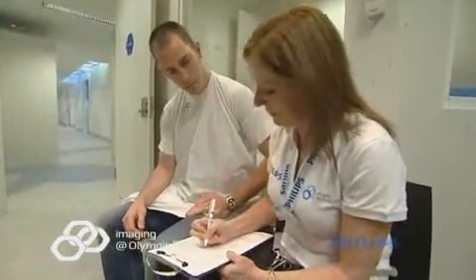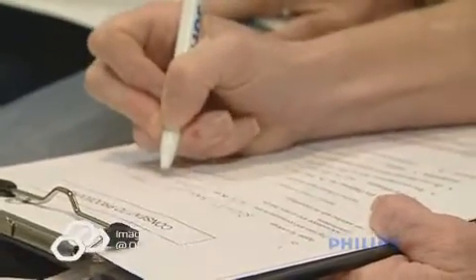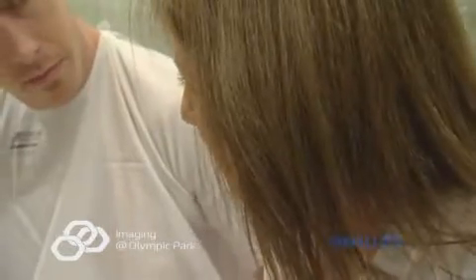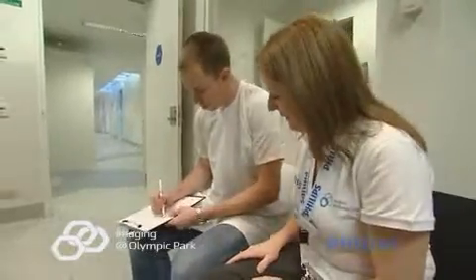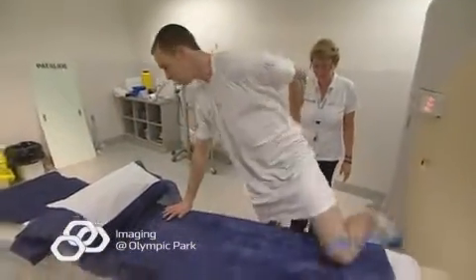Complications of a CT-guided facet joint injection are uncommon, but do include bruising, infection, and local soft tissue injury. Rarely, facial flushing can occur, but this is not serious and almost always settles down within a few days. You will be asked to sign a consent form. A CT scan is a safe and painless examination.